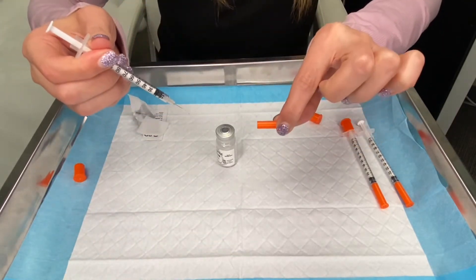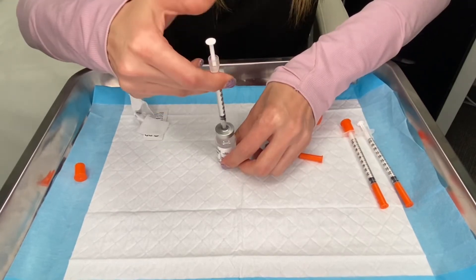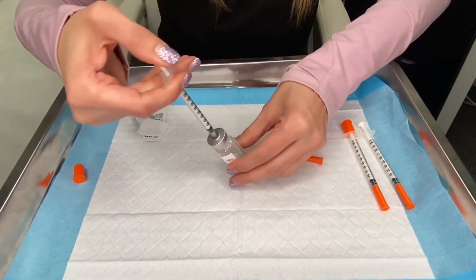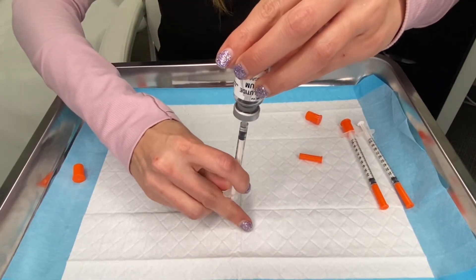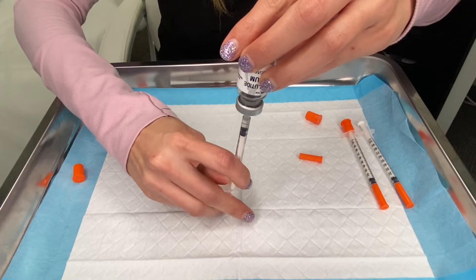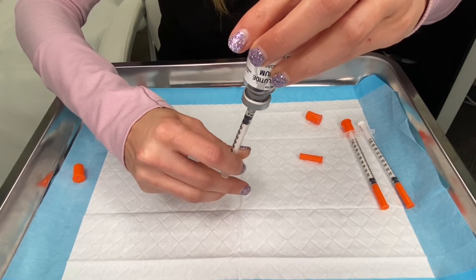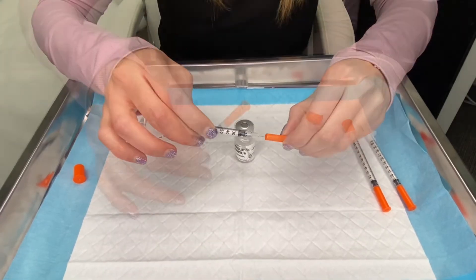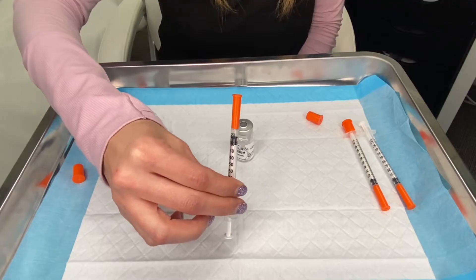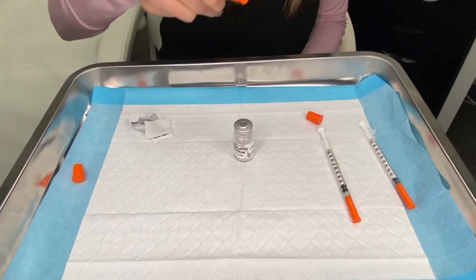You can then take the cap off and put the needle into the vial, push the air in, invert your vial, and pull down on the plunger until the medication starts to fill the syringe. Go to the 10 unit line, put the cap back on — that is the 0.25 milligram dose, and that's the dose for the first four weeks.